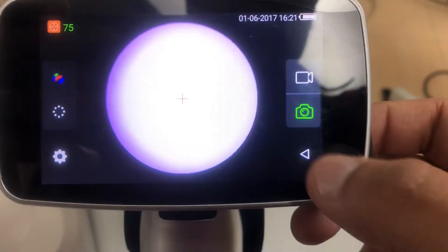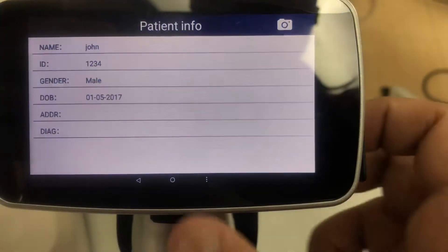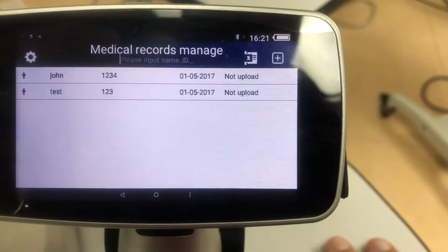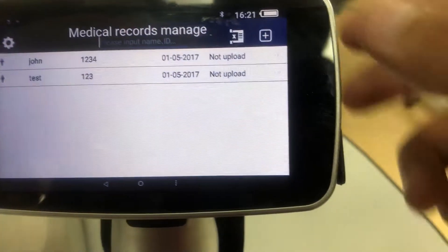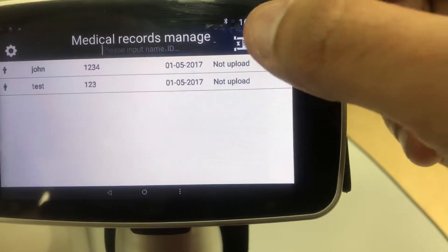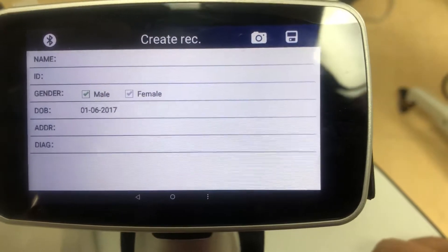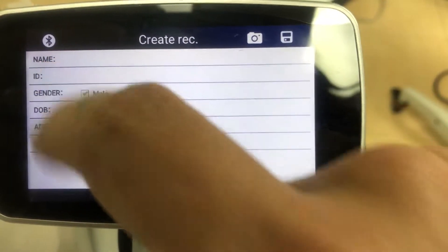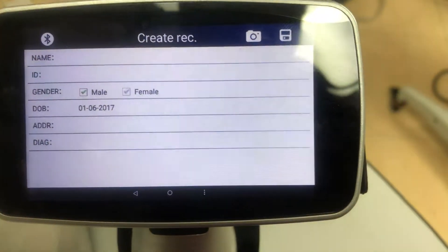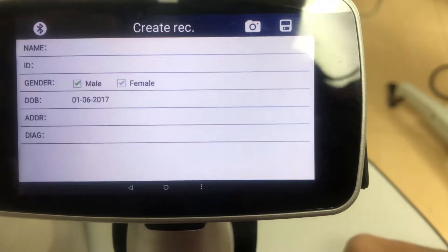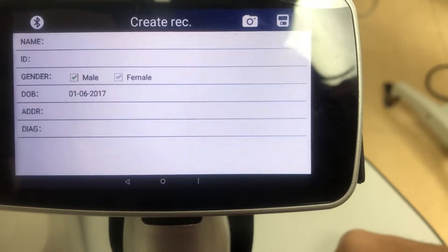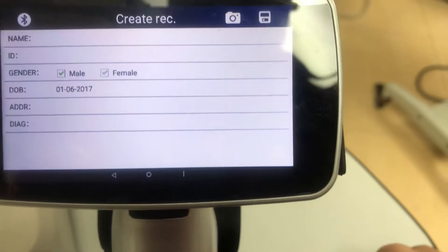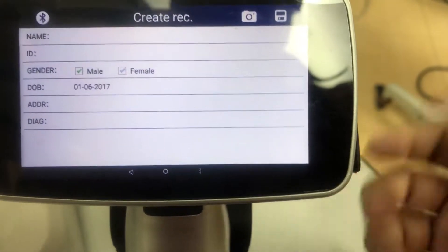I'm going to show you how to add a new patient, and adding a new patient is really simple. You're just going to select the little plus symbol on the top. Here you're going to input their name and you want to input the ID. If you do not put an ID number, it will not allow you to save it, so it's very important to put an ID number.